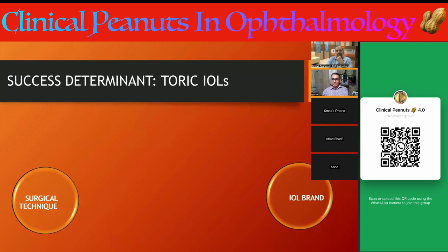IOL brand does not make a difference. As per the larger study, the rotational stabilities of almost all the lenses are almost similar. What determines success in toric IOL is the pre-op calculation, the understanding of corneal power and all.